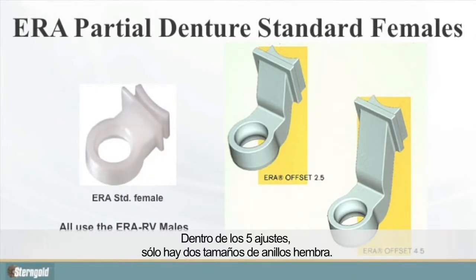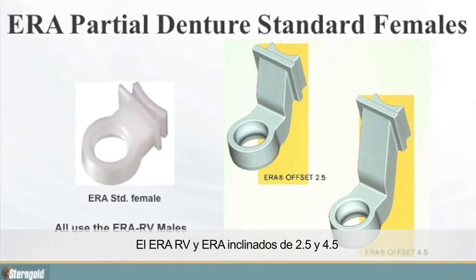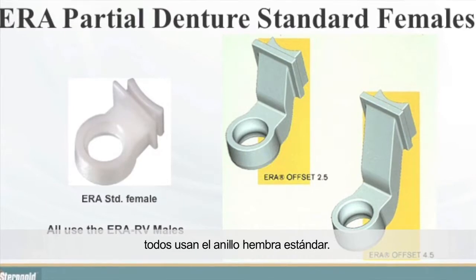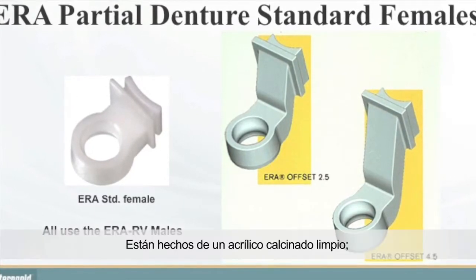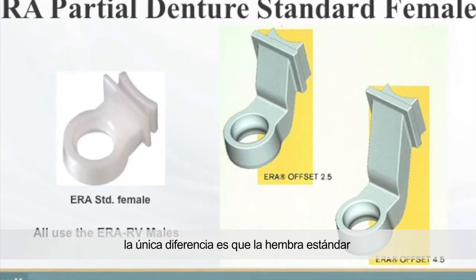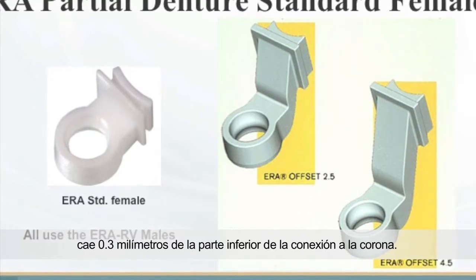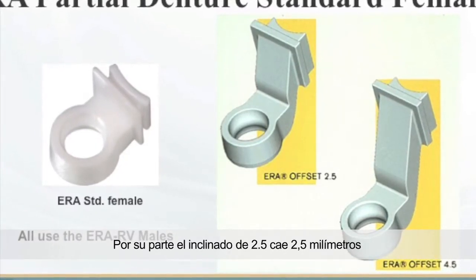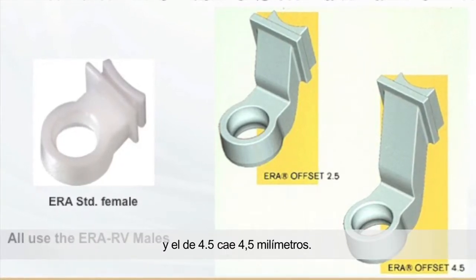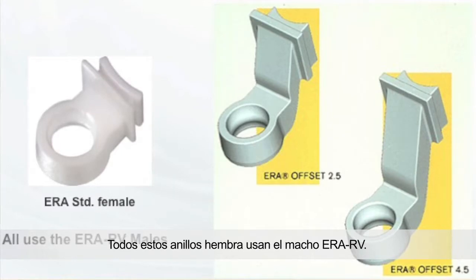Within the 5 attachments, there are just 2 sizes of female ring: the ERA RV and ERA offsets 2.5 and 4.5 all use the standard size ERA female ring. They are all made from a clean burnout acrylic. The only difference between these 3 is that the standard female drops 0.3 of a millimeter from the bottom of its connection to the crown, whereas the offset 2.5 drops 2.5 millimeters from the bottom of its connection, and the 4.5 drops 4.5 millimeters. All of these females use the ERA RV males.